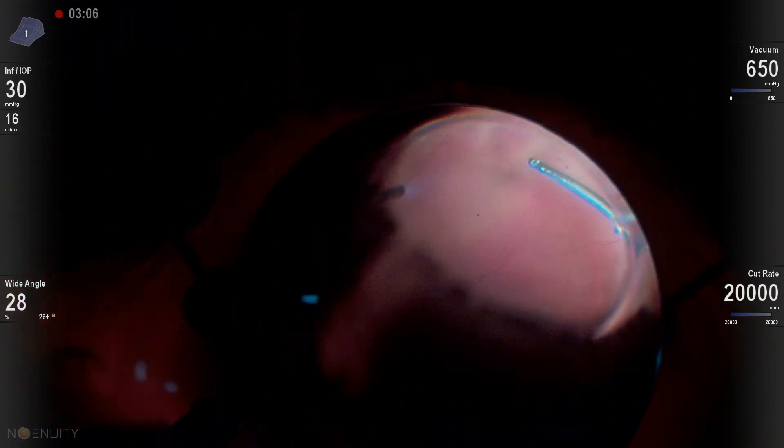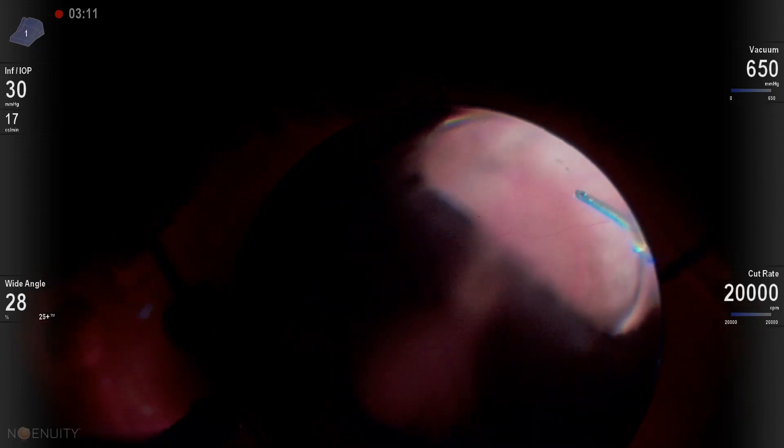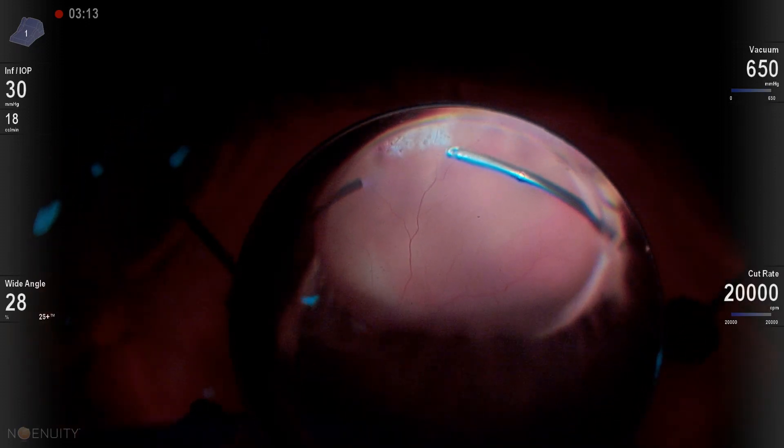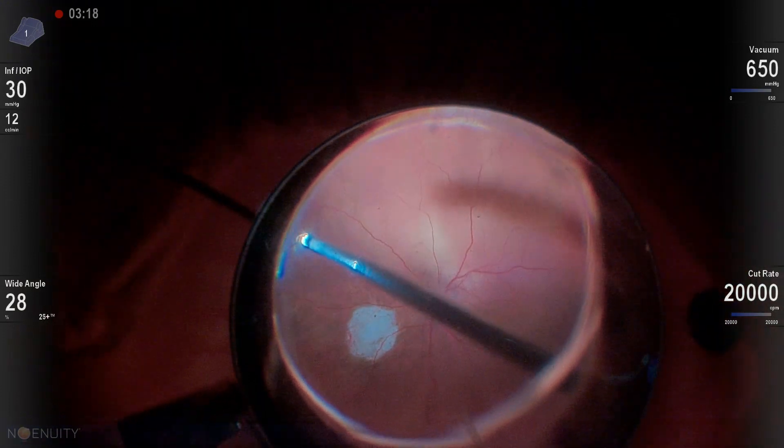I felt like we didn't need to put another buckle on this patient's eye. I felt like we just needed to get in there and tamponade that area. And if I had seen that this retina was overly stiff, I was going to put a buckle on the eye or do a retinectomy.